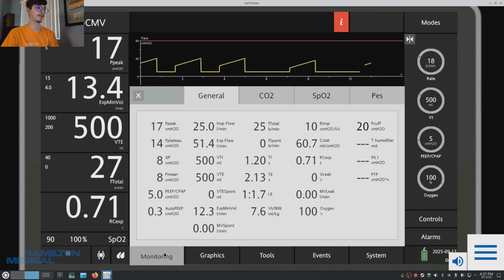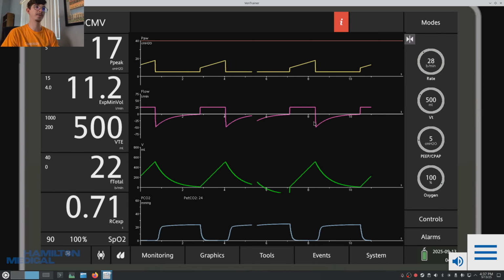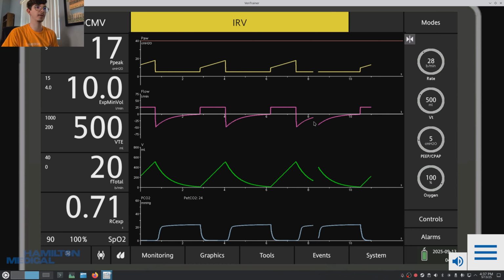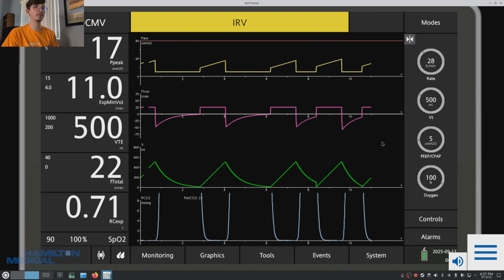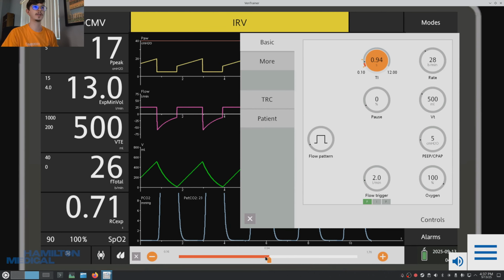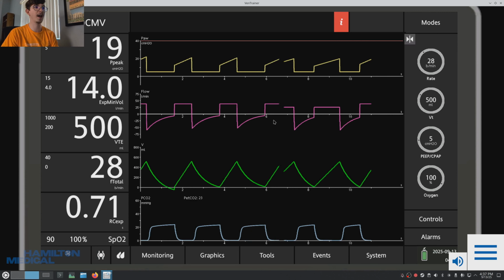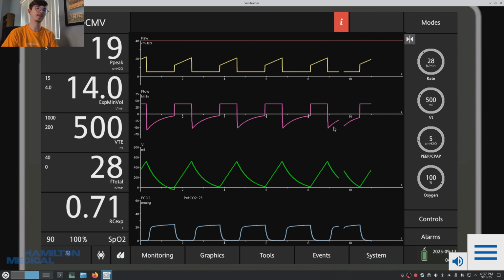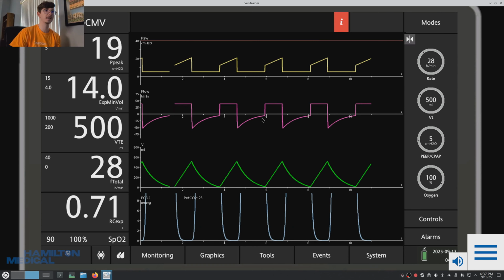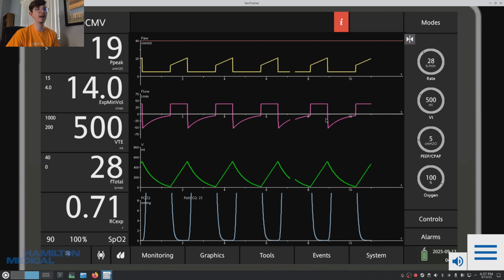See that? But let's say hypothetically, the patient is just breathing really fast for one reason or another. Maybe they're agitated, who knows? Something's going on, and they're just breathing really fast. Well, what else can we do? Okay, well, we can decrease the I time a bit, right? Go down to 0.8. Let's see. That may or may not be enough to actually fully resolve it. No, not quite. But you can see that there's a difference in that gap now. The gap is lower, right? See, that will help. In reality, you should address why the patient is breathing fast, because you're not really going to be able to solve that auto PEEP. But those are the types of things you can do to try to help with that auto PEEP.